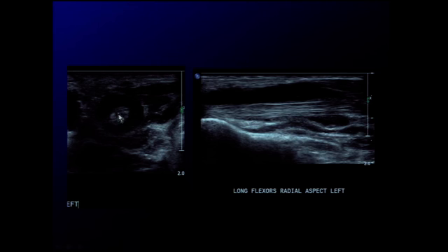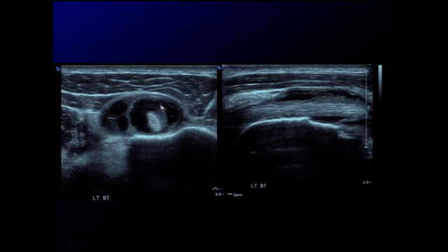Here is the biceps tendon, possibly with a hypoechoic or nodular area, and fluid and possibly debris within the tendon sheath. In long view, you can see the hyperechoic collagen fibrils and some loss of architecture with nodularity within the tendon and fluid in the tendon sheath. This is biceps tenosynovitis. The tendon sheath may become thickened, may develop webs or adhesions or synechia, and the fluid may not always be simple, but sometimes complex.